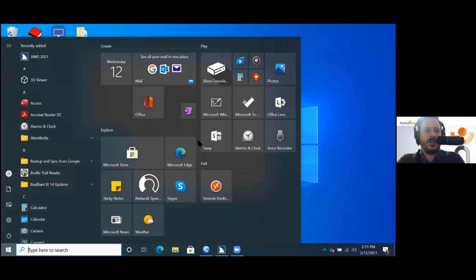It goes very, very deep, including how do I get the time and date and battery status and all of those. So again, the takeaway here is, if you're running JAWS 2018, 2019, or 2020, you need to install the JAWS drivers. Once you have those drivers installed, you need to make sure you are paired via Bluetooth if you're using Bluetooth. Otherwise, you'll plug in via USB-C, your USB-C cable. You will go in and you will need to make sure that you have added your device. Once added, your Braille will be set up. You have to do it through JAWS. Choose your appropriate Braille display.